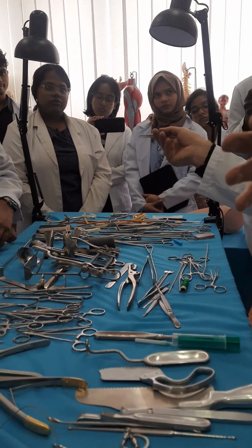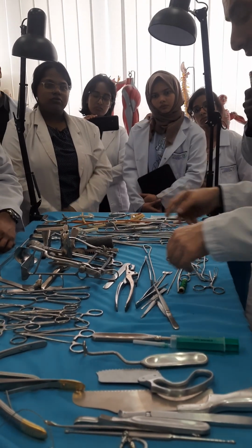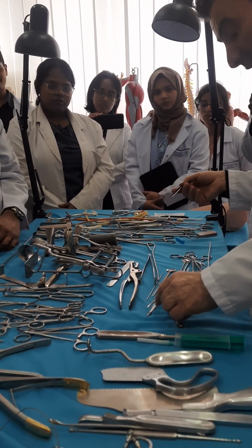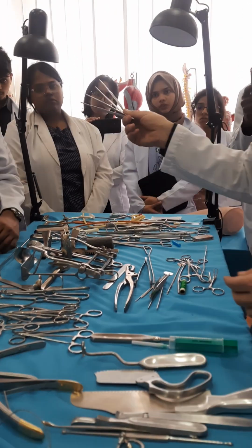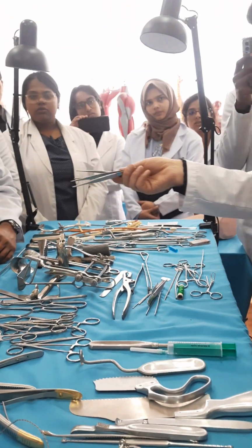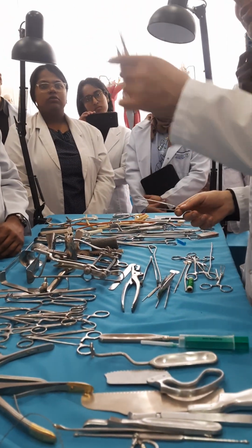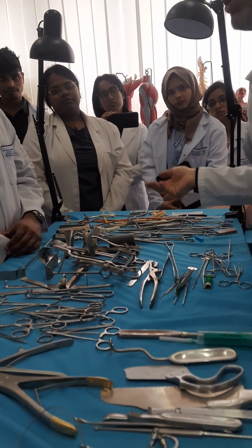That's gripping. By the way, we hold it in pen grip position, as you can see. By the way, there are different types. First main types, you can see here, with the teeth. We call surgical; without, with the grooves, we call anatomical. Of course, this is much more polite. Of course, this is much more traumatical. Let's say, according to what you want to grip.